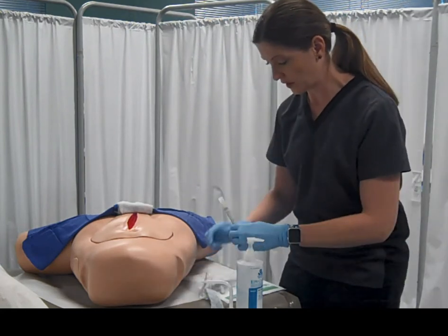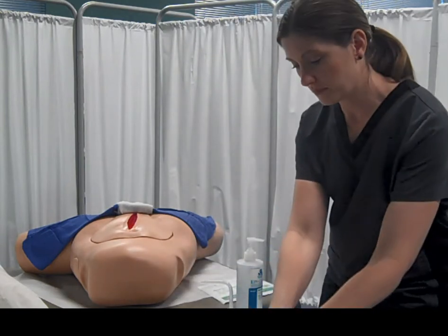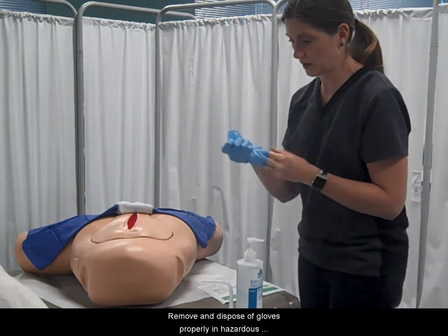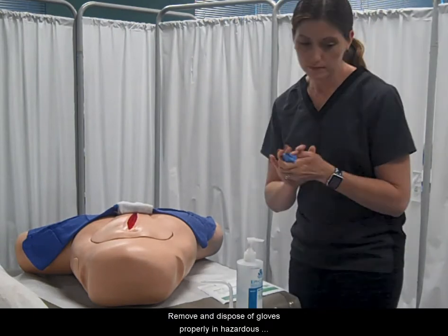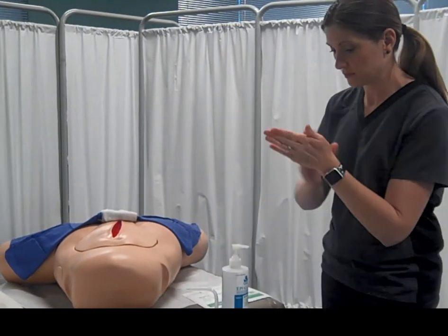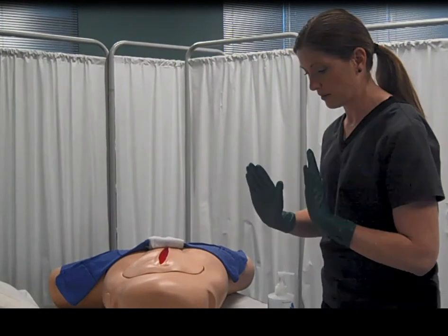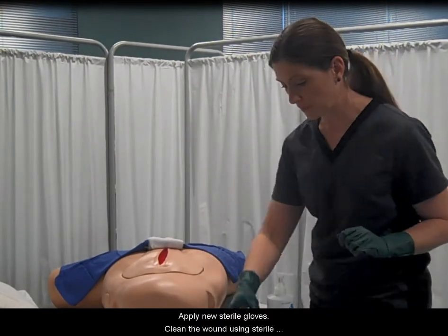Verify that the tube is labeled. Remove and dispose of gloves properly in a hazardous waste container. Perform hand hygiene, then apply new sterile gloves.